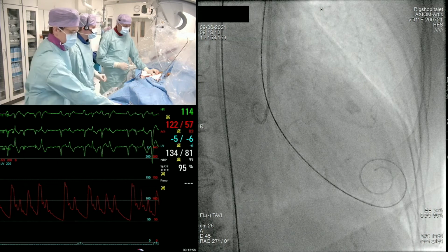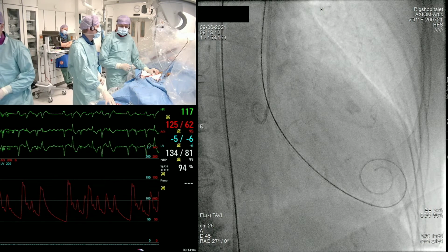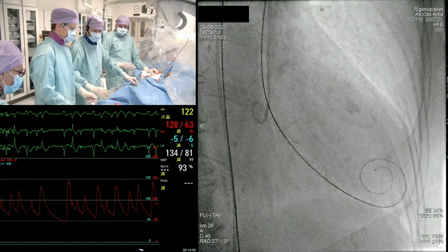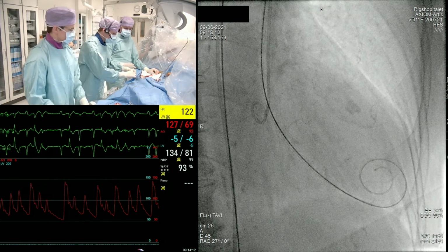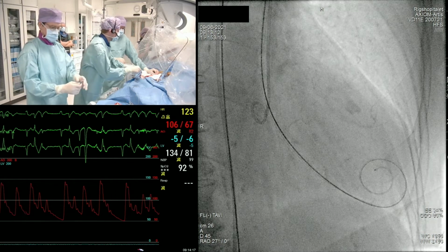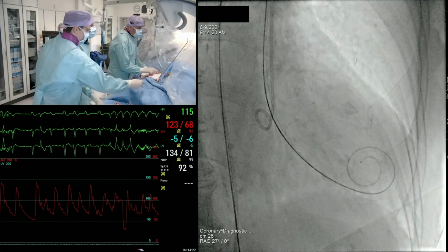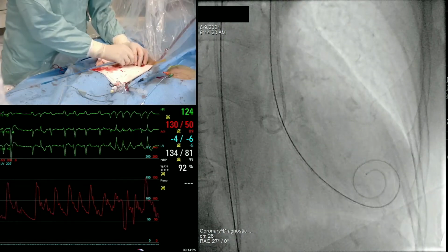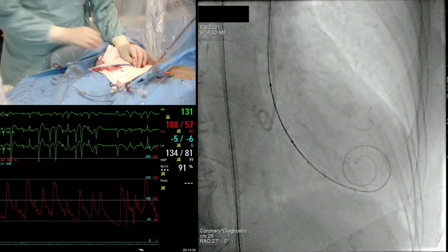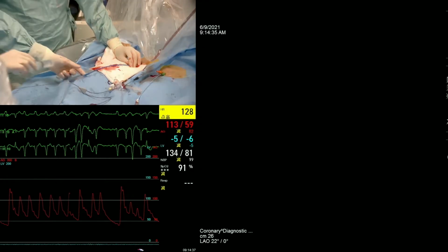So it's even a tiny bit smaller than the minimum diameter in the LVOT. The minimum diameter was 21.4, so we go for that 21 in order to avoid any damage to the conduction system. It's actually our routine here now for pre-dilatation. If you want to do a pre-dilatation, we often only use a balloon which is not exceeding the minor axis of the aortic annulus. And again, this is of course the balance between avoiding annulus rupture and severe aortic regurgitation on one hand, and on the other hand opening up the aortic valve for better expansion of the stent frame.